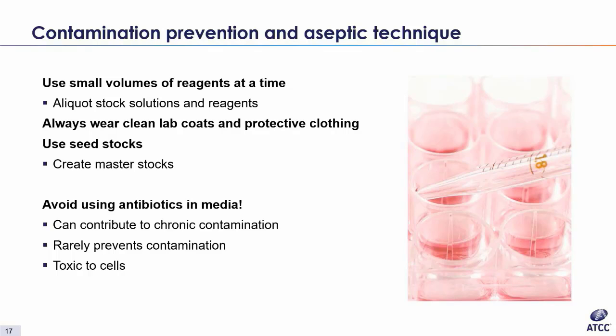There are a few reasons, in addition to the potential of toxicity. If you use media with no antibiotics and a contaminant enters your cell culture, chances are it will be visible within a couple of days. You can then discard the infected dishes. However, if there are antibiotics present, it may slow the growth of the contaminant, allowing further passages and freezing down of your cell lines. In short, you may be saving large amounts of contaminated cells that can cause problems down the road.